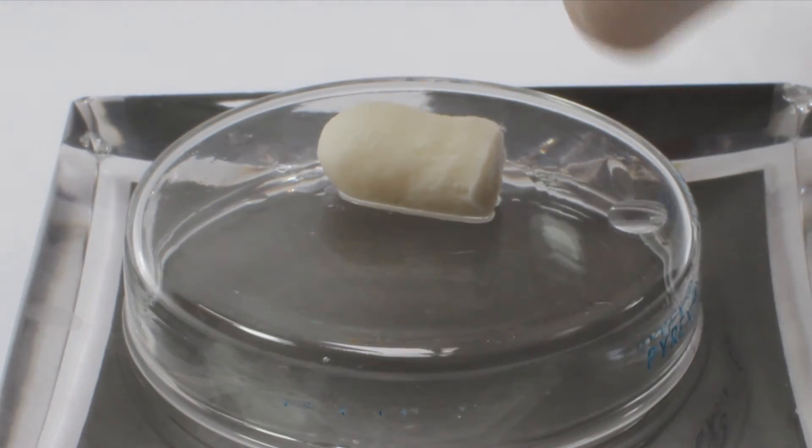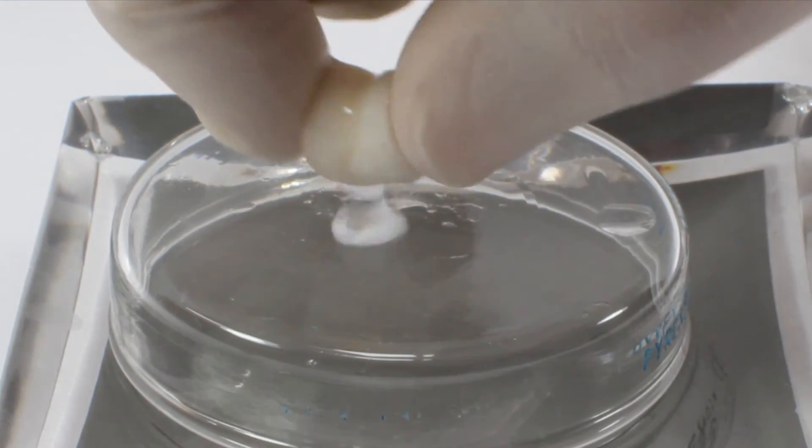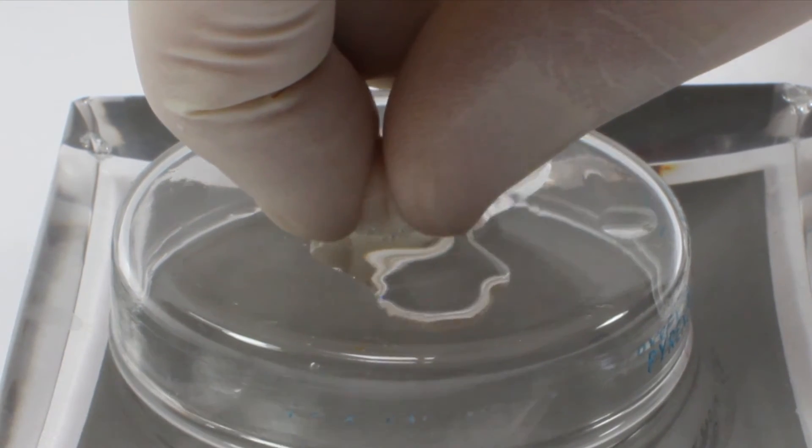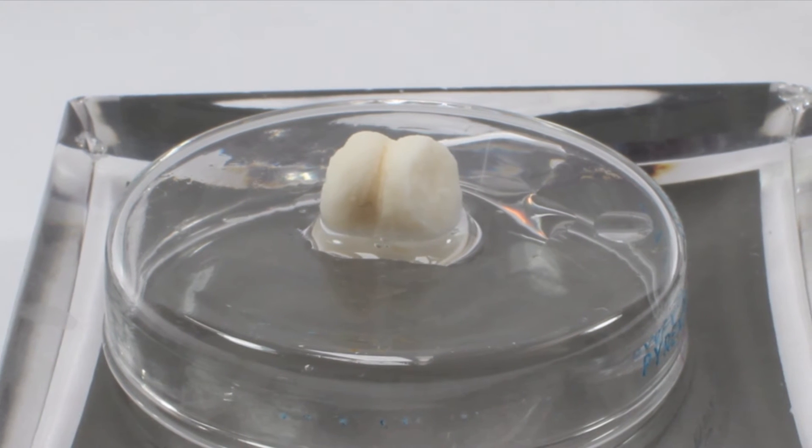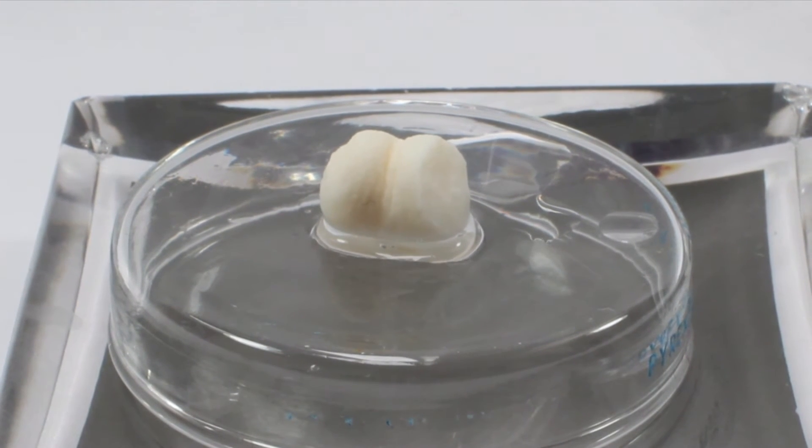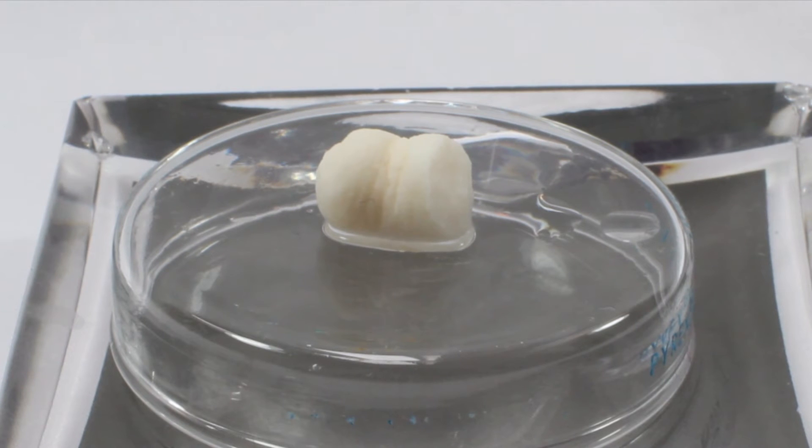The Osteogen plugs have shape memory and following the absorption of blood they will predictably retain their shape, which presents an advantage over putties and particulate grafts which may migrate and become hard to contain. Even after absorbing blood, the Osteogen Plug retains its hydrophilicity.